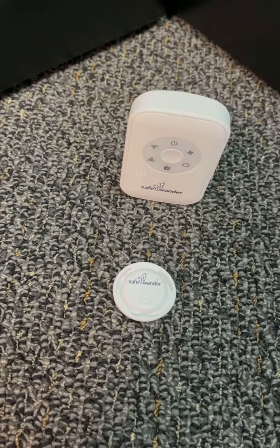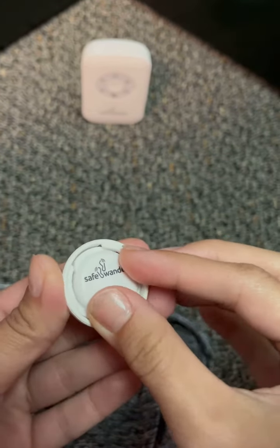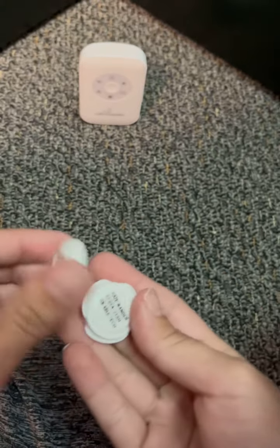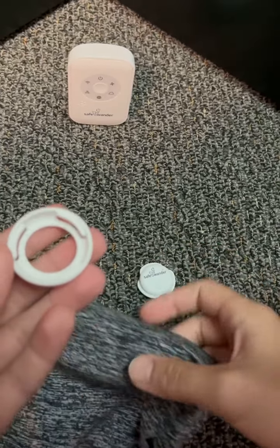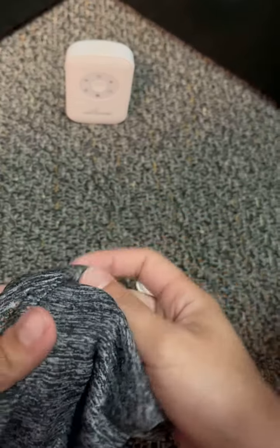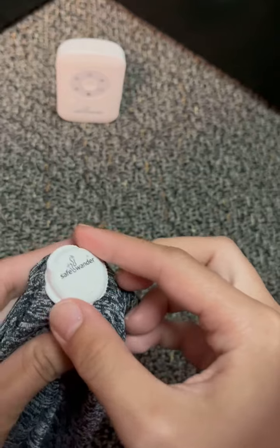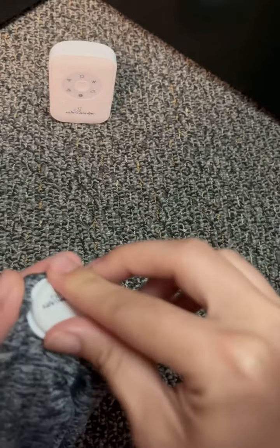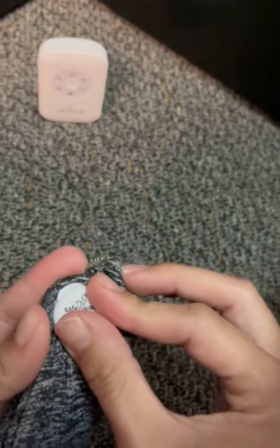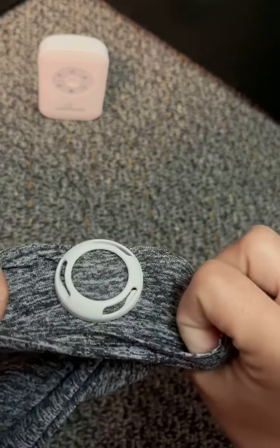This is how to attach a SafeWander clothing sensor to an article of clothing. Take the sensor and turn it — this will release it from its holder. Then take the holder, put it inside of a piece of clothing, take the sensor and turn it clockwise. Now the sensor is snug on this piece of clothing.